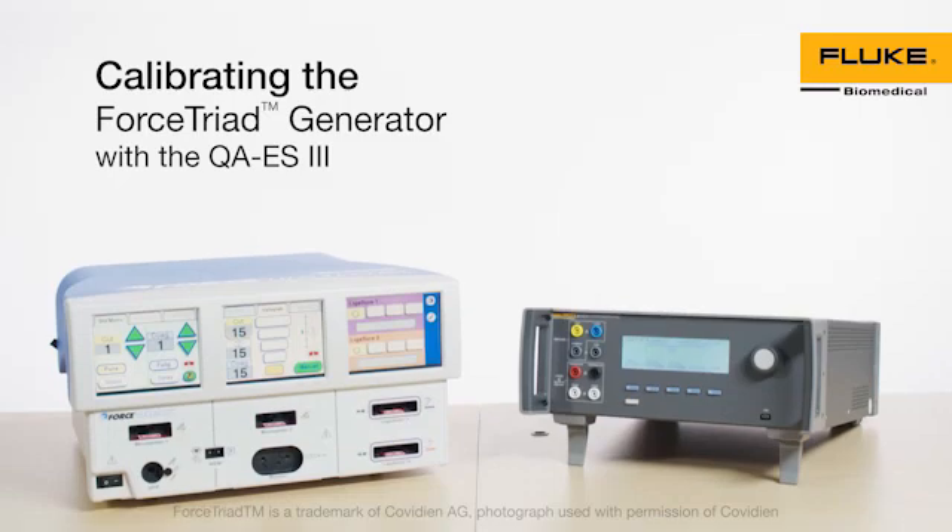Force Triad Energy Platform Preventive Calibration with QAES-3. This video demonstrates how to perform calibration on the Force Triad Energy Platform using the Fluke Biomedical QAES-3 Electrosurgical Analyzer.